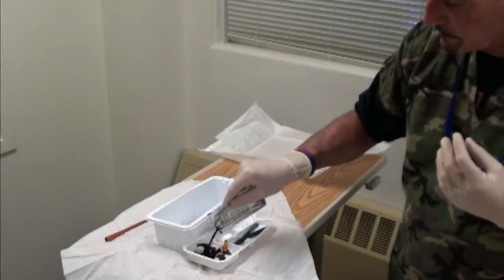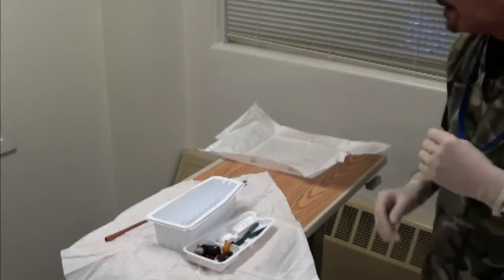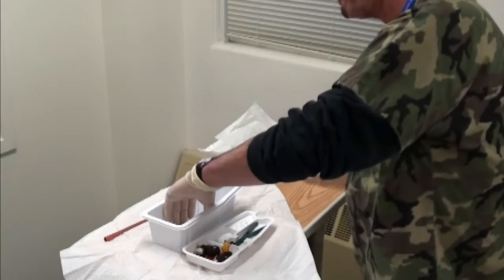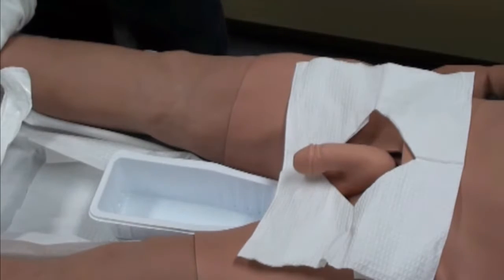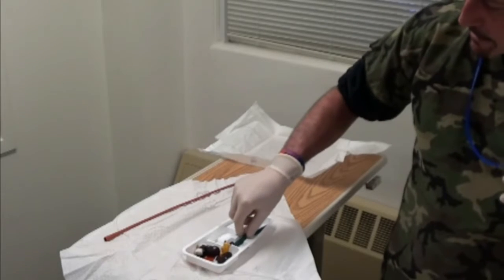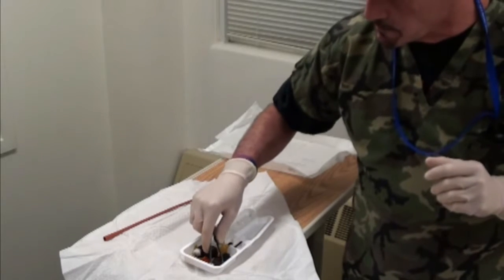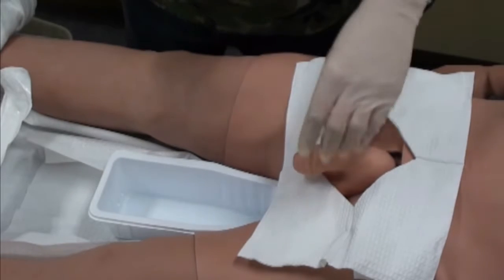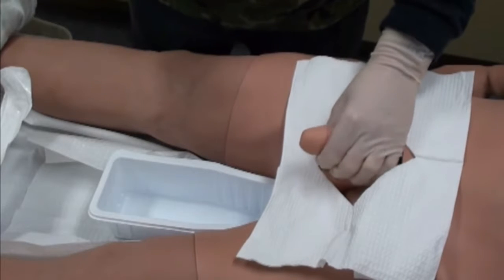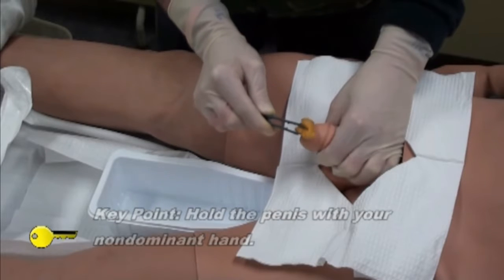Some of these come with swabs as opposed to cotton balls that are pre-treated with the povidone iodine. I'm going to place the tray under the penis. If the patient has foreskin, I'm going to retract the foreskin. I'm going to take tweezers and grab a cotton ball, and holding the penis at a 90-degree angle, I'm going to start from the center and move to the outside.